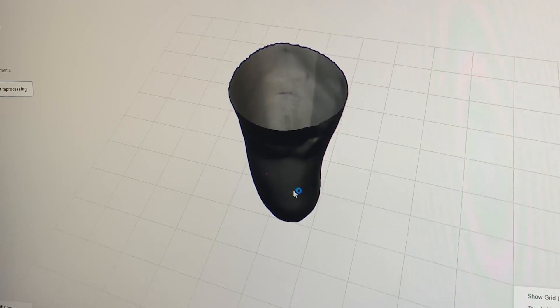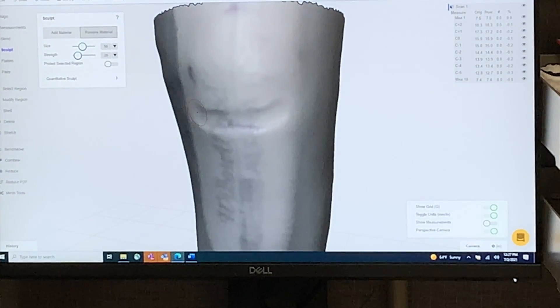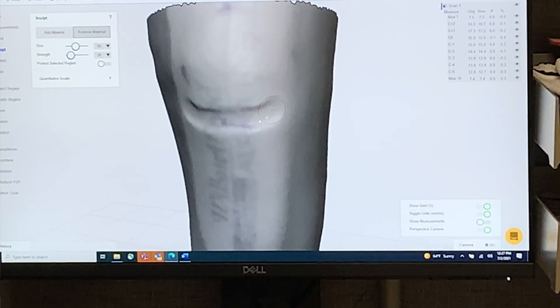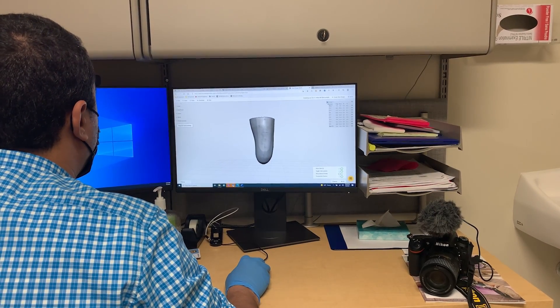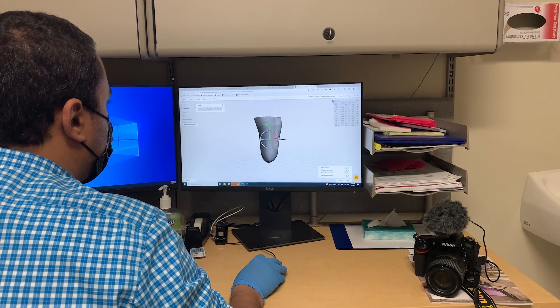In the CAD software we can do a couple of modifications, and after that we upload it into our slicer and do our 3D printer settings. It takes about an hour to print, depending on the kind, the volume, and the shape of the socket.